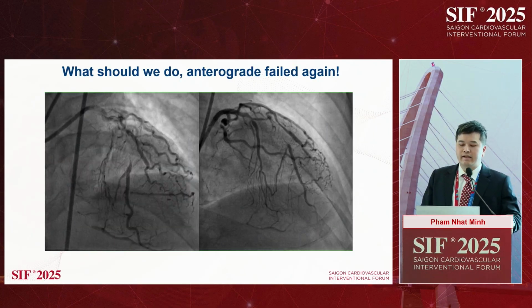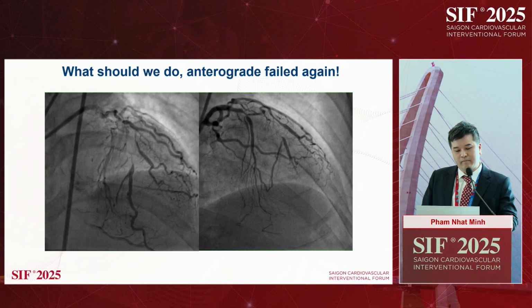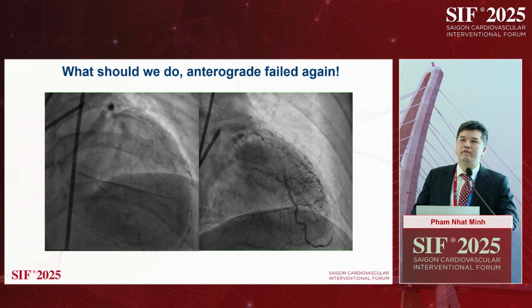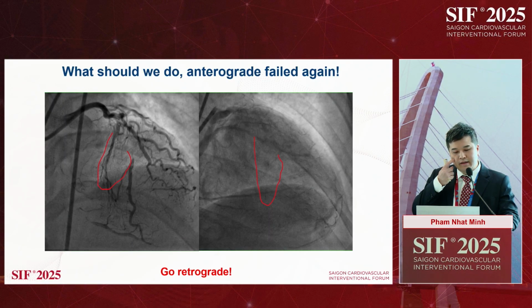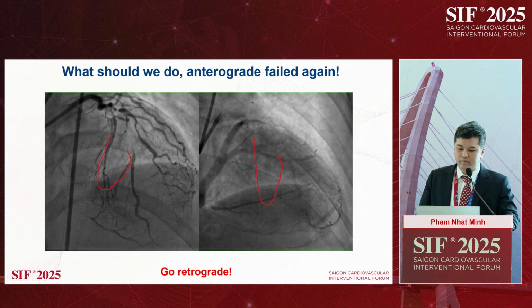After a while of wiring, we really failed. At that time, we really wanted to stop and transfer the patient to CABG. But then I thought we could still try the retrograde approach with the septal.